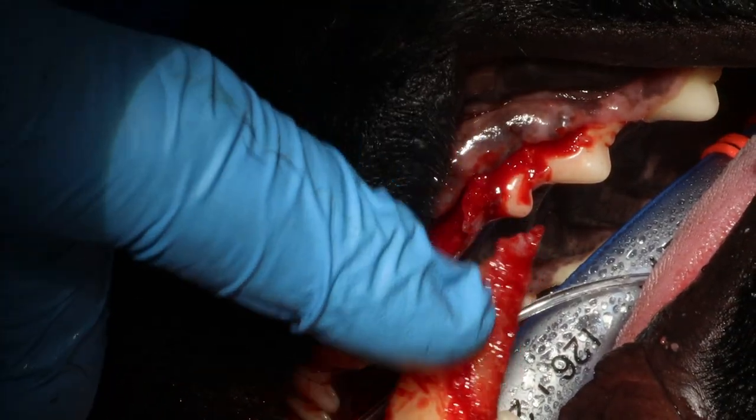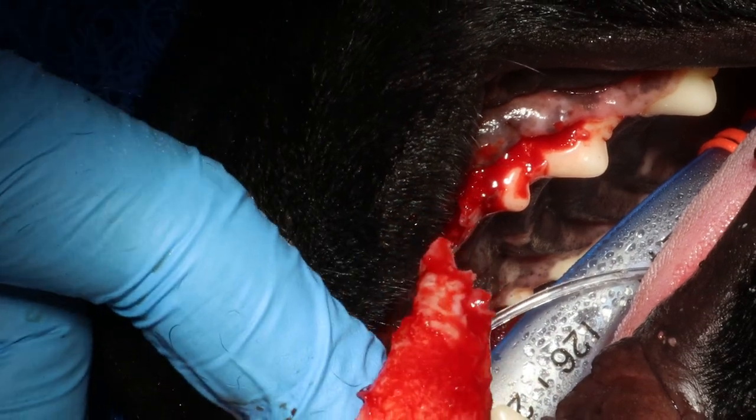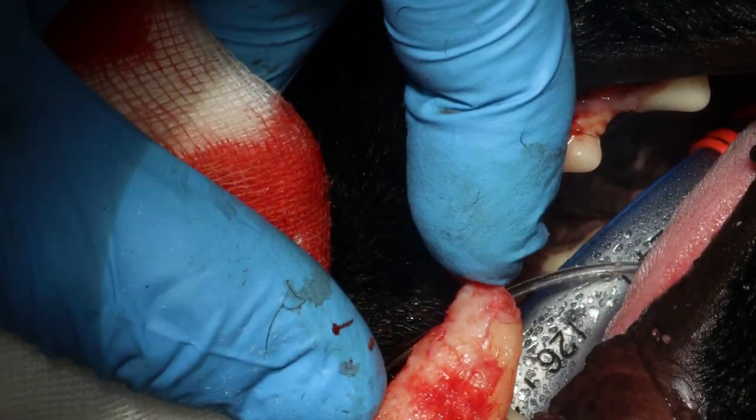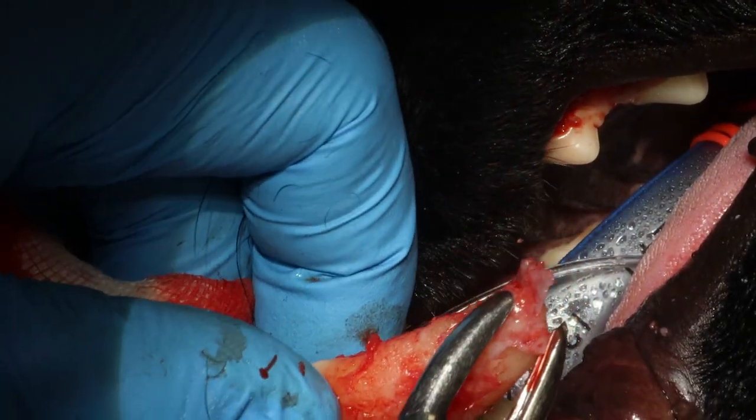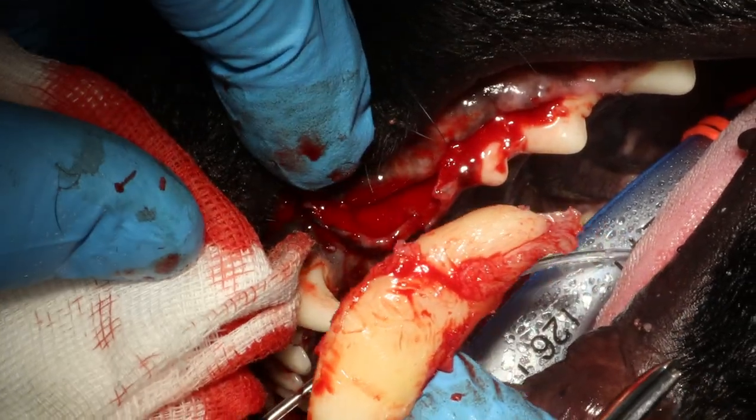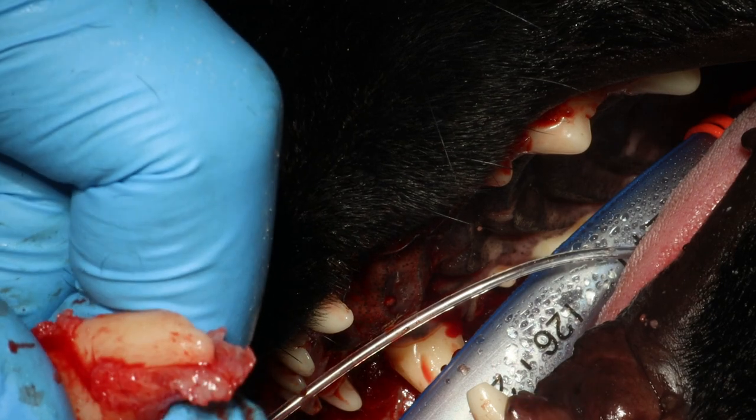You can see some lining — some material here on the root tip. This is due to chronic irritation because this tooth was dead. So this is not normal.